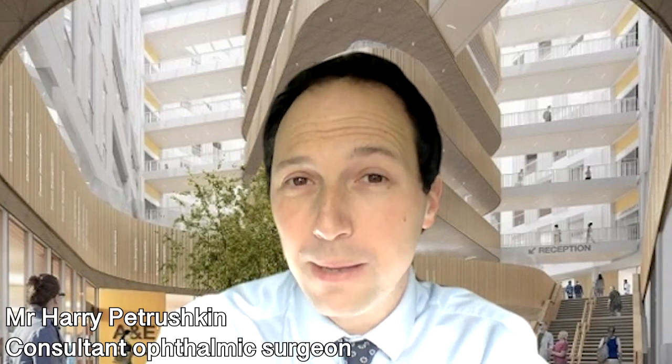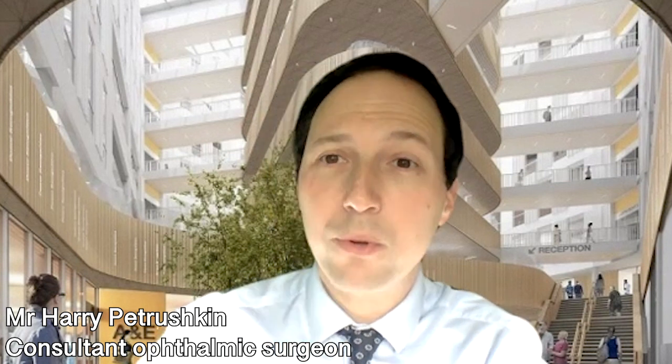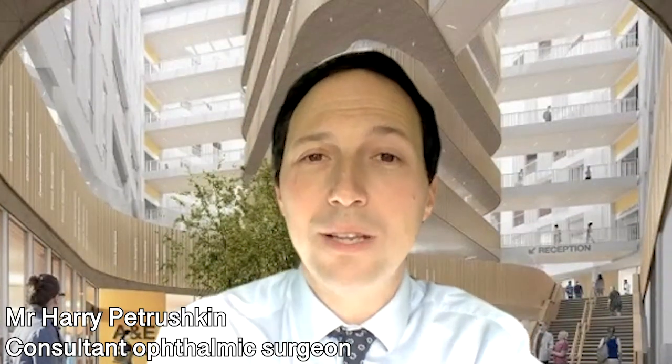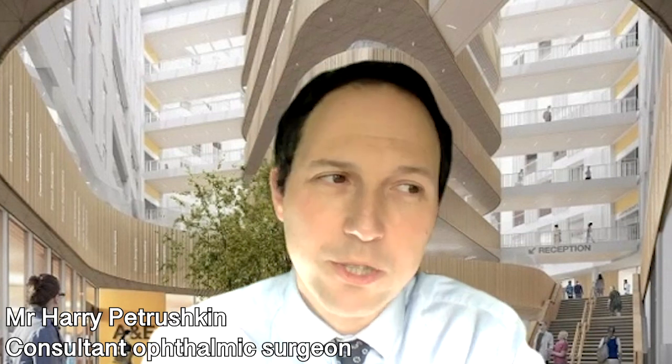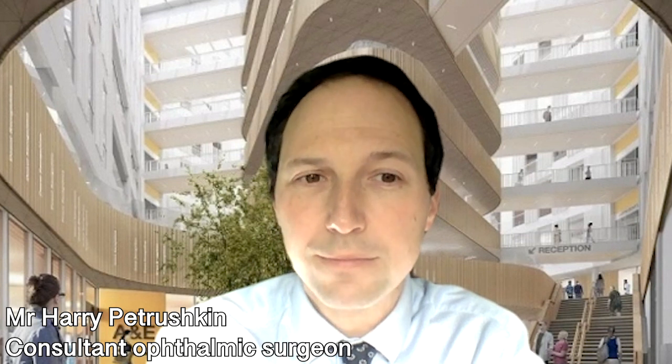1 in 100 people will need more than one operation, but ultimately end up with a good visual outcome. And 1 in 10 people will need the lens polishing 6 to 9 months after the operation with a laser, which takes 5 minutes in clinic and is not a surgical procedure.